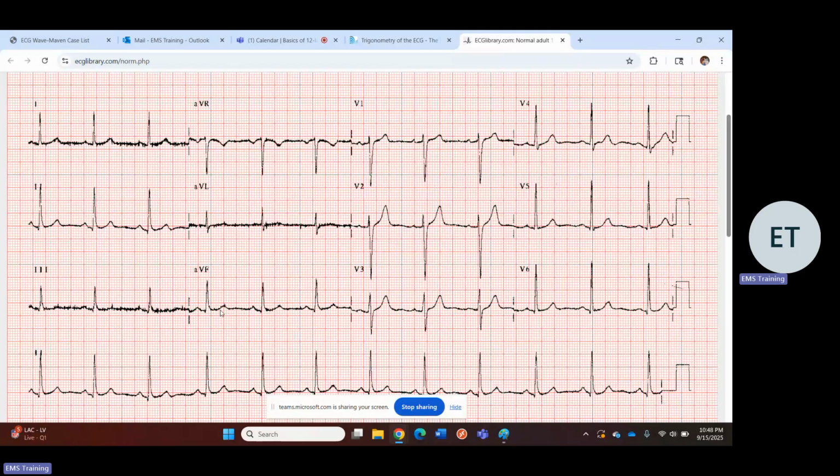There's nothing better than a patient to shave, in my opinion, because I can make shave marks exactly where the EKG leads could go. That way, all future EKGs will probably be placed correctly. So, all right, let's get into it.